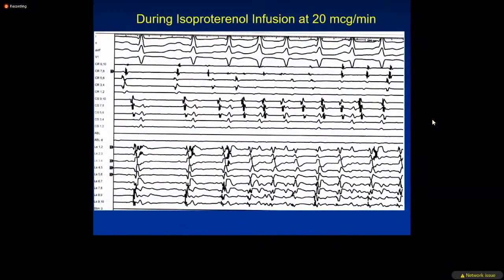Okay, look at this again. Coronary sinus is, so what is the earliest? The earliest is on top. And I show you the picture where the catheter was, that is the superior vena cava. The activation is actually even more cranial than the sinus beats. The sinus beat earlier is like the mid crista. Here earliest is very high on the crista. So this is SVC. The CS is late, so there is no way that the CS has any role in this patient.